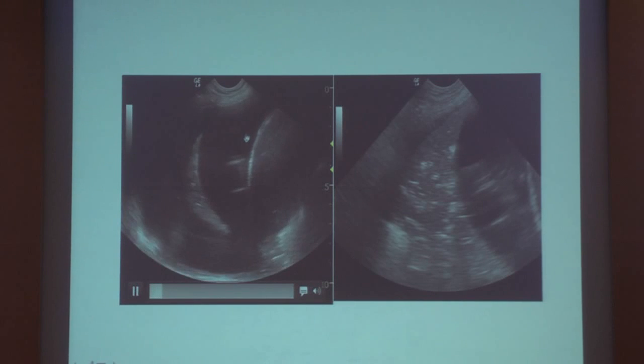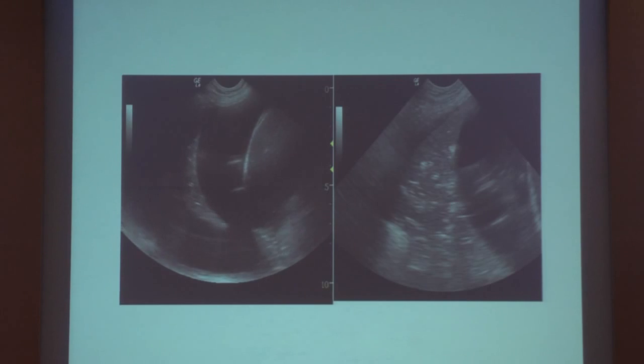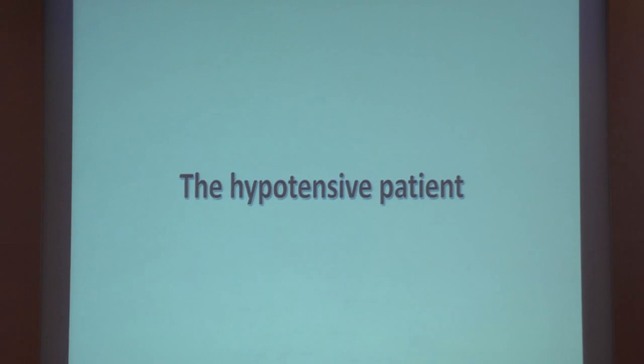It is a massive pleural effusion that you see here. The lung is floating within the fluid like a jellyfish. It's called jellyfish sign. So pleural effusion is, again, very well recognized on ultrasound. You just need very minimal training.